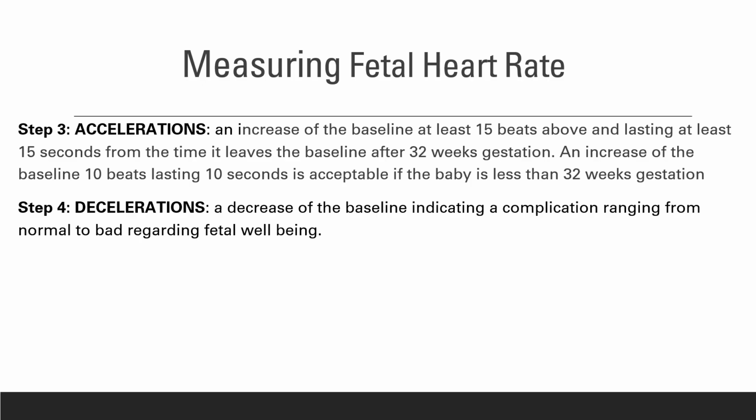There are good decelerations, and then there are also bad decelerations, depending on the situation. Again, the terminology that you see in front of you is very, very important. Please make sure you understand what a baseline is, what is the variability, what is an acceleration, and what is the deceleration as you're measuring fetal heart rate tracing.